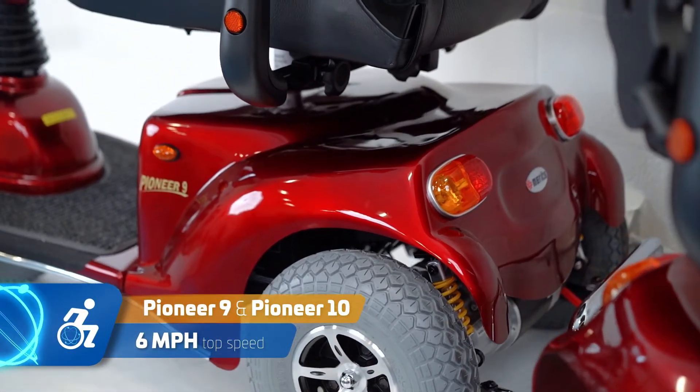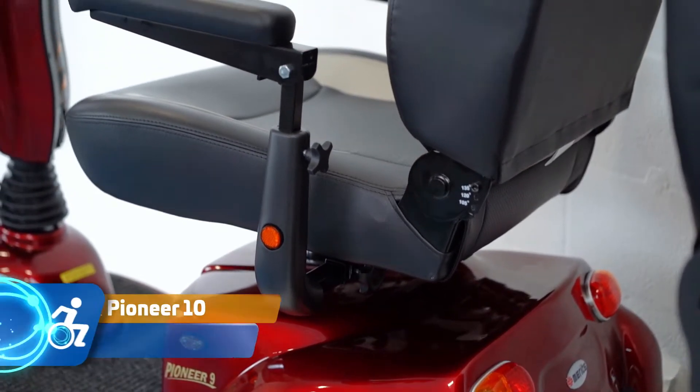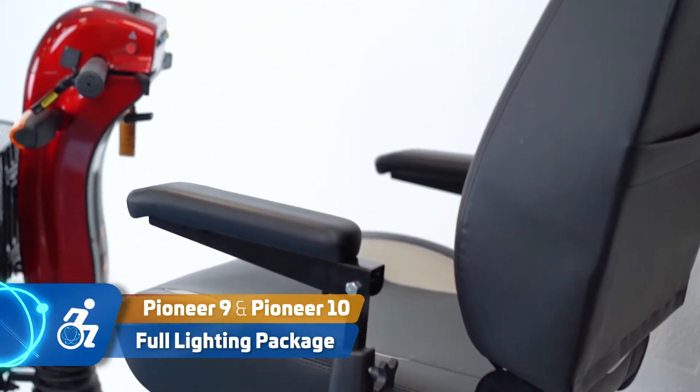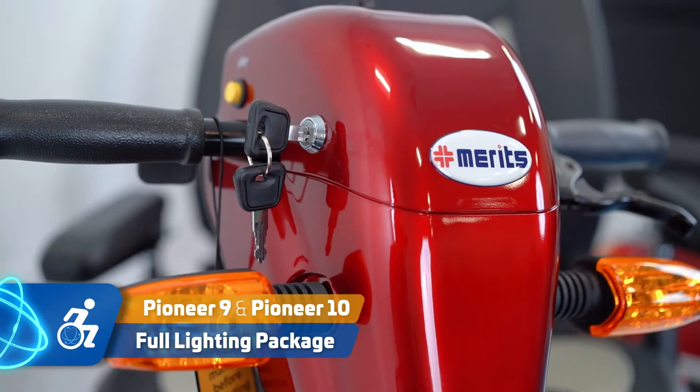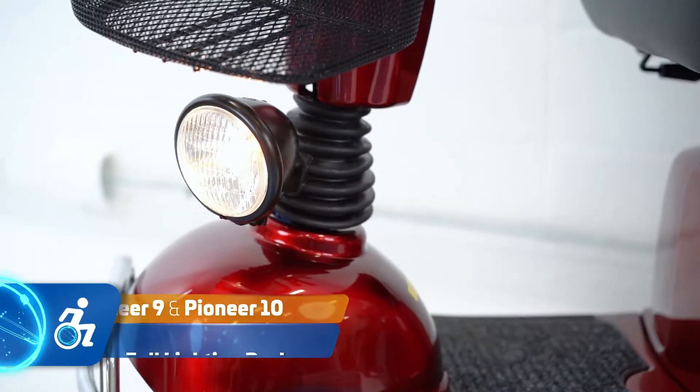It has a luxurious two-toned captain seat with padded armrests. It has a lighting package that includes hazard lights, left and right blinkers, and both the three-wheel and four-wheel models have a bright headlight.